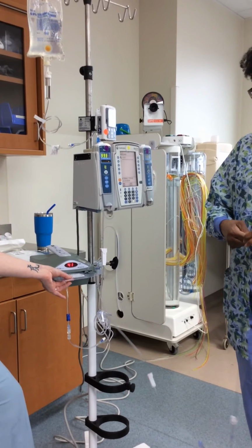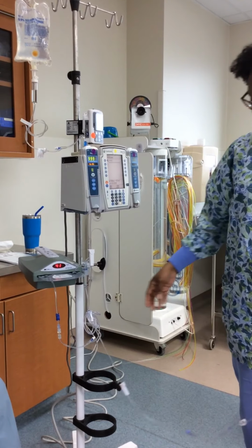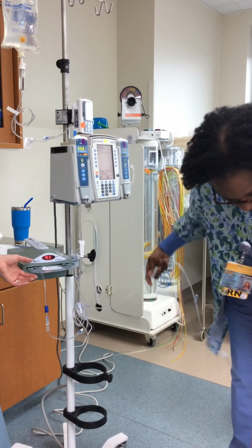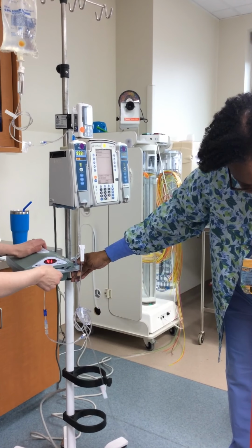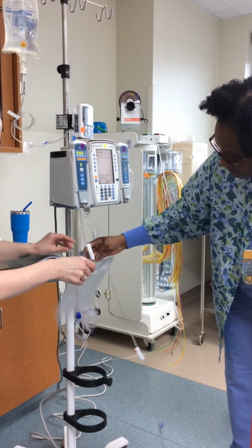So I've attempted to pull a little bit and it has not released, so we're going to let a little bit more fluid out. And now this was able to pull out.